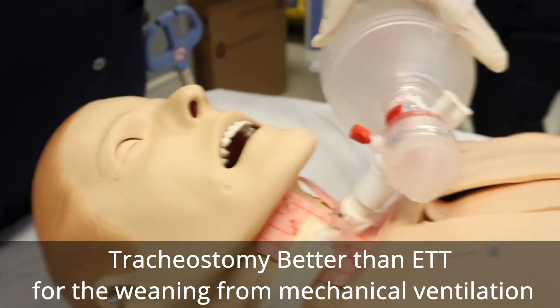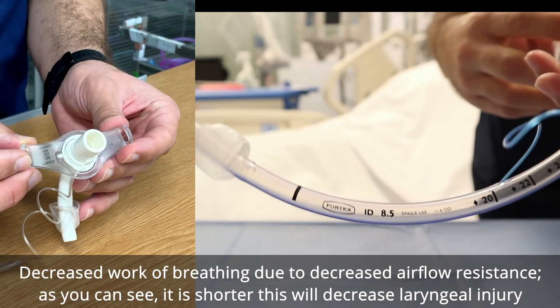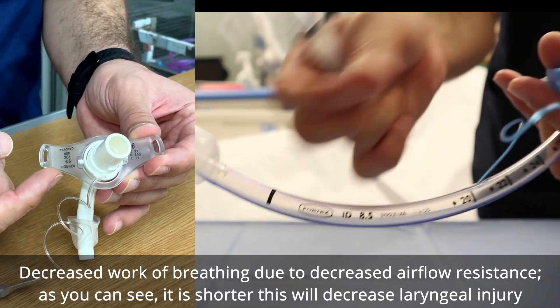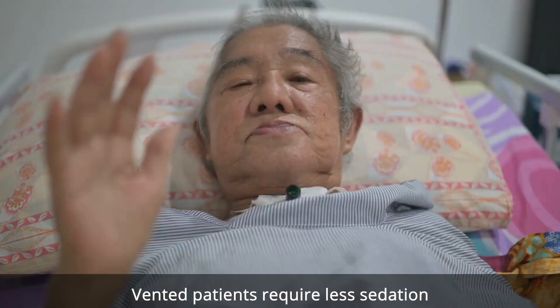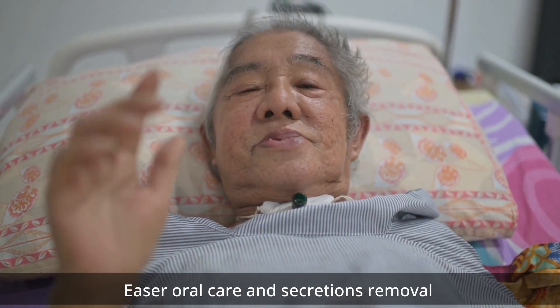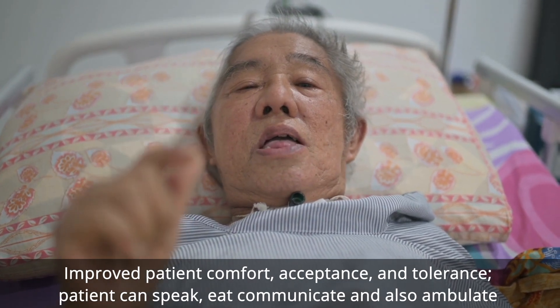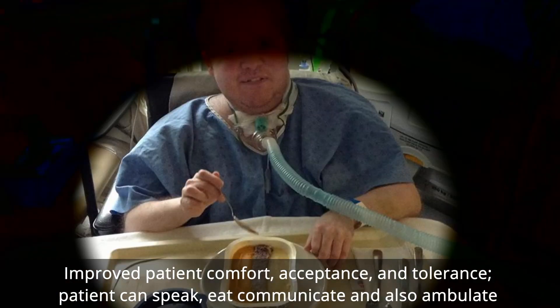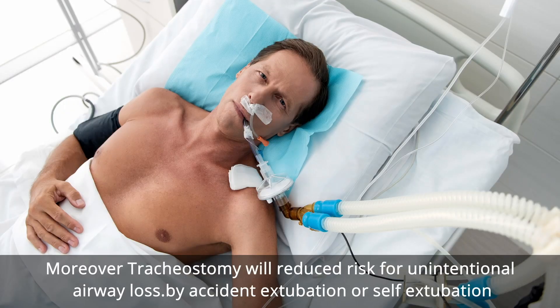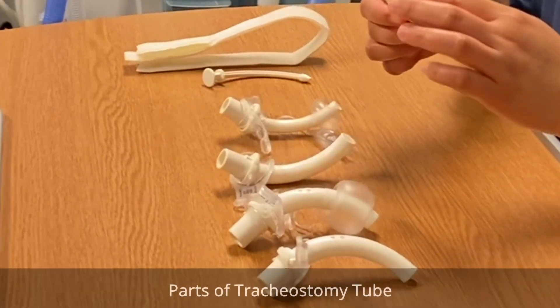The advantages of tracheostomy over the endotracheal tube include: better weaning from mechanical ventilation, decreased work of breathing because it is shorter, decreased laryngeal injury, less sedation required, easier oral care and secretion removal, improved patient comfort and acceptance. The patient can speak, communicate, eat, and even ambulate.